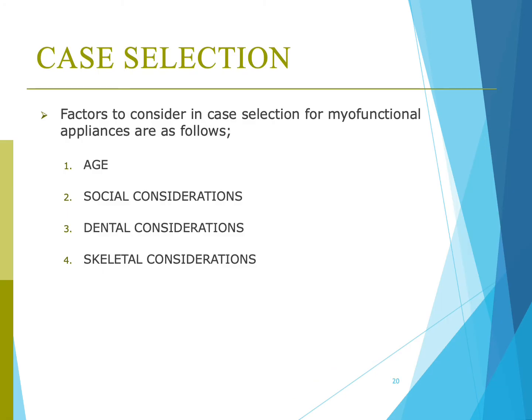There are a few factors to consider in case selection for myofunctional appliances. The factors are as follows. First, age. Second, the social consideration. The third one is dental consideration. And the final one is skeletal consideration.